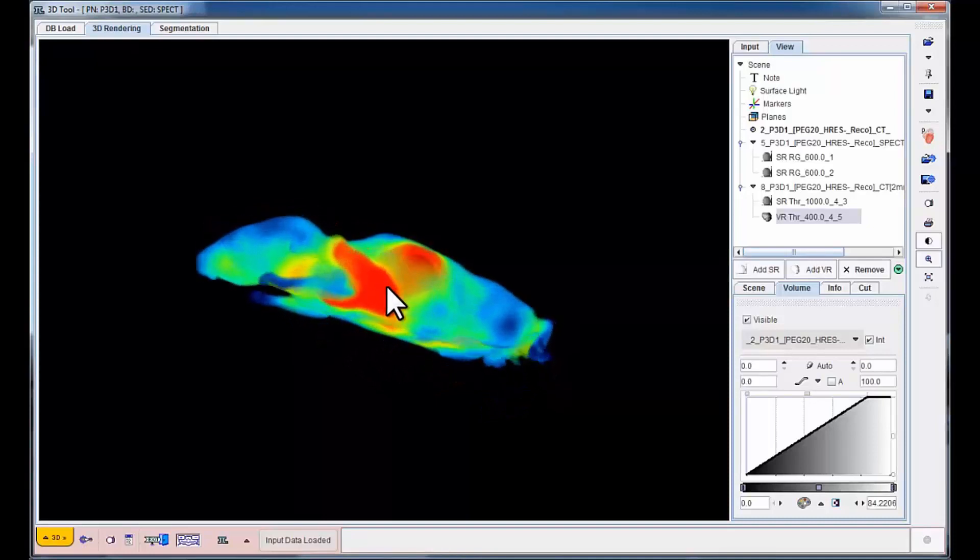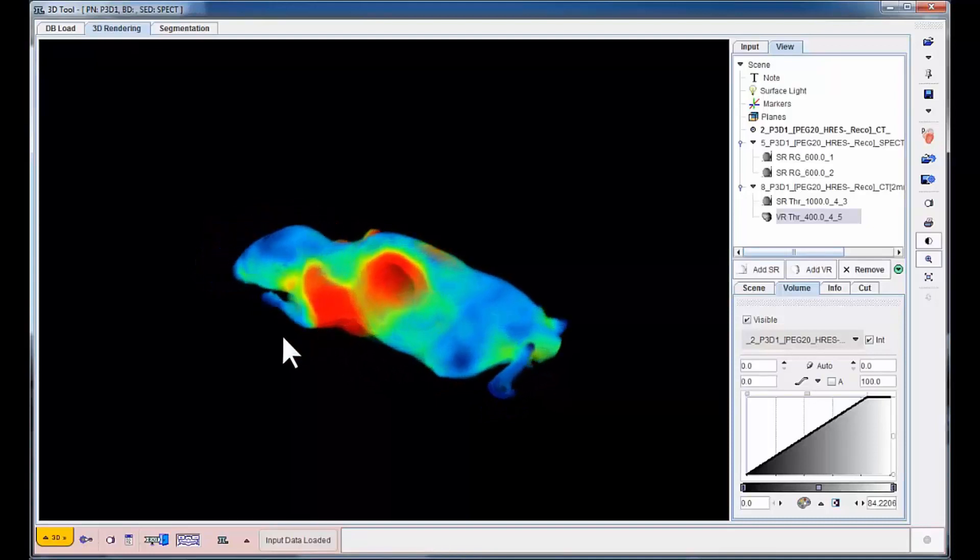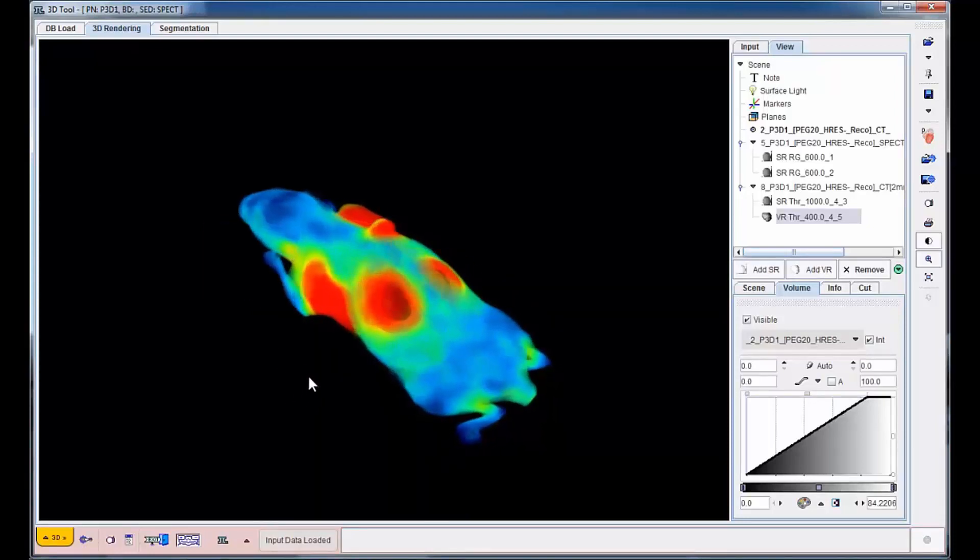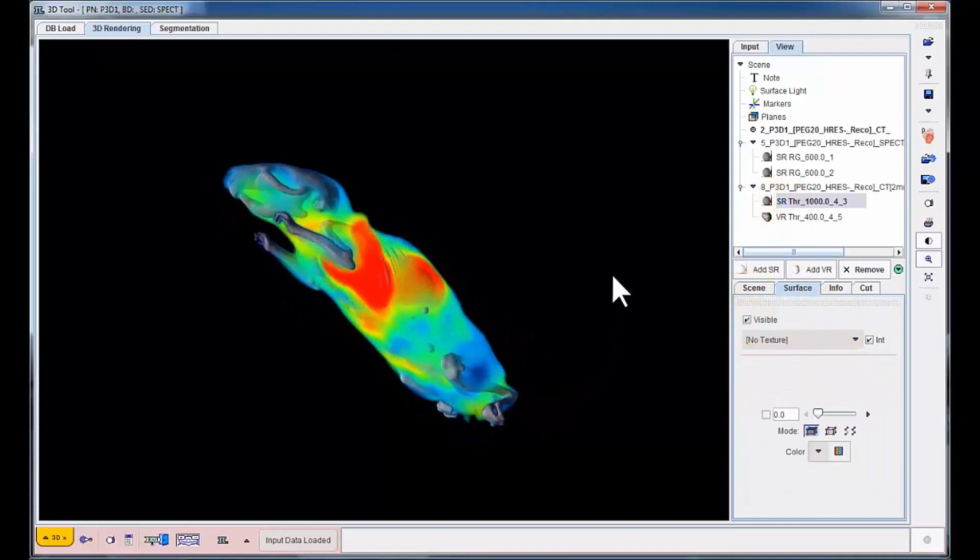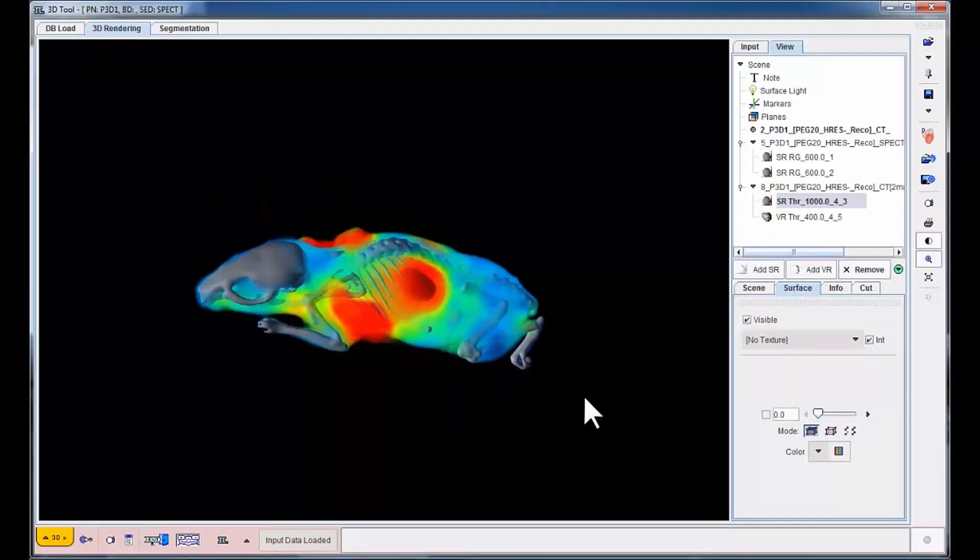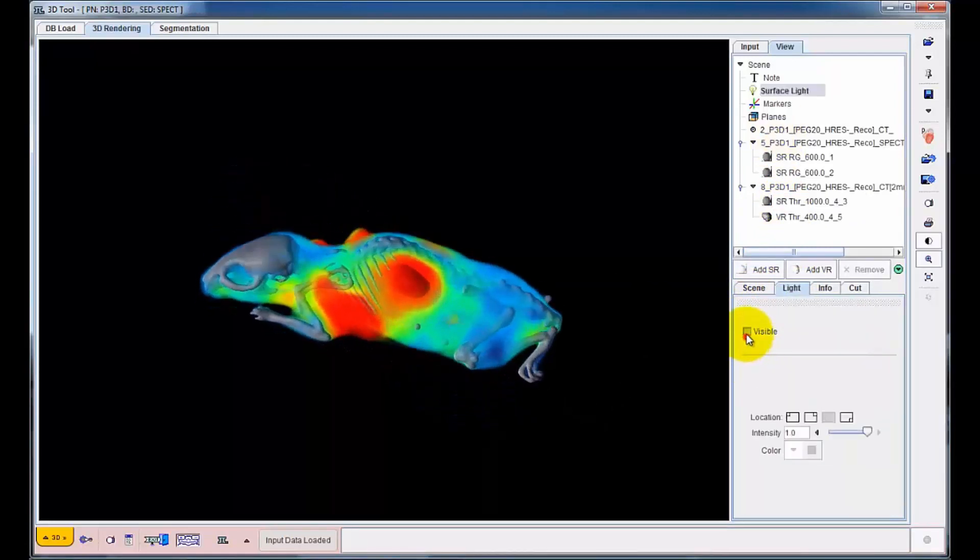To add visual interest and anatomical guidance, the skeleton surface rendering is restored and combined with frontal surface lighting.